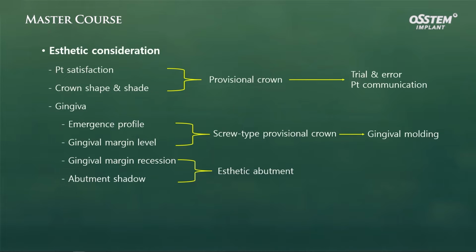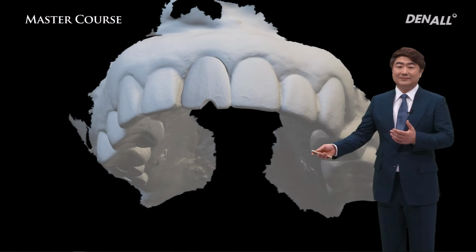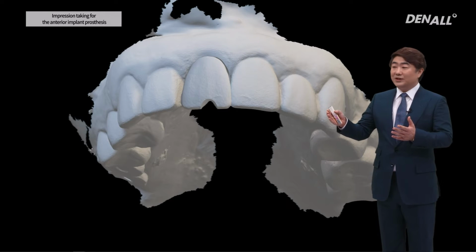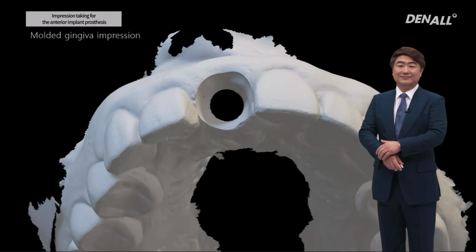Lastly, if an aesthetic abutment is used in the final delivery, any negative impact from changes in the gingiva, like the margin level or the abutment shadow, can be minimized. In other words, in achieving these goals, you deliver this screw type temporary and go through various steps of revision, like this, until the patient is satisfied and the gingiva molding is sufficiently done. Then you take an impression or scan it.